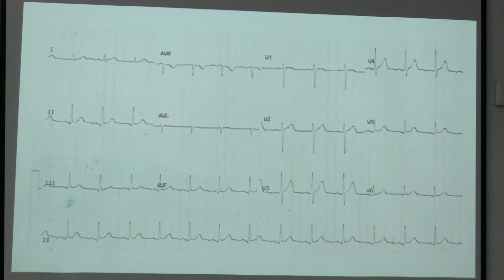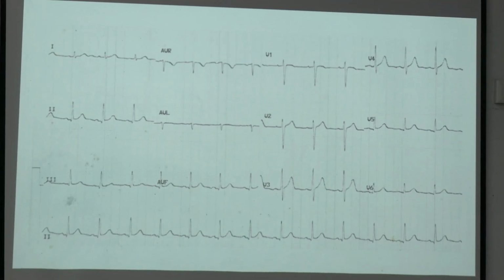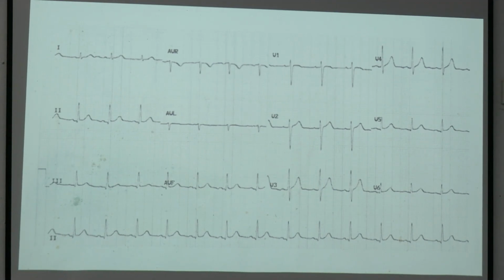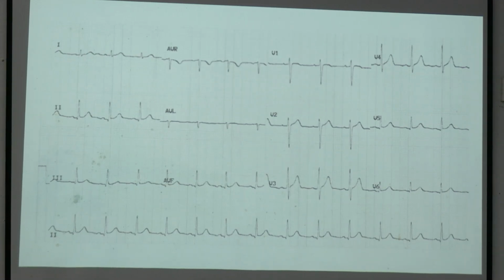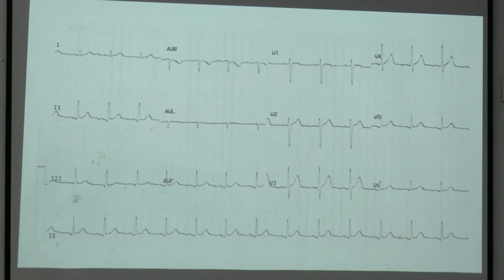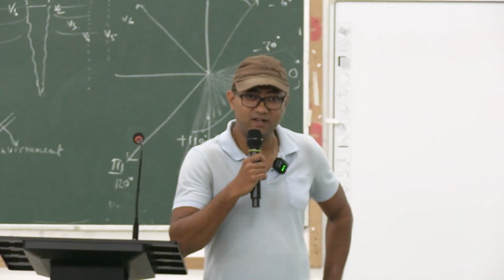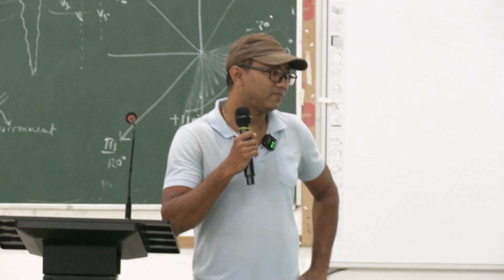There are multiple ways, and all the ways you need to understand, because there is a mathematical way, number one. To calculate exact axis in the mathematical way, you need to have a scale, a pencil, a protractor, to measure the angle.